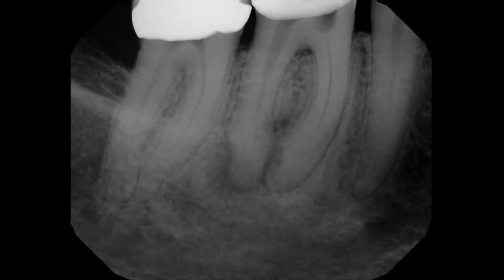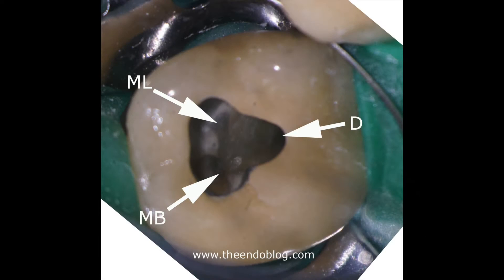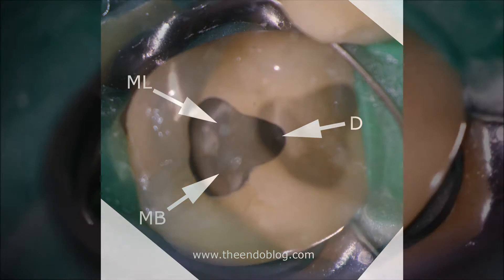This root canal was started by a dentist who was unable to find the mesial canals. Using a microscope, we're able to easily find the canals and get them opened up.